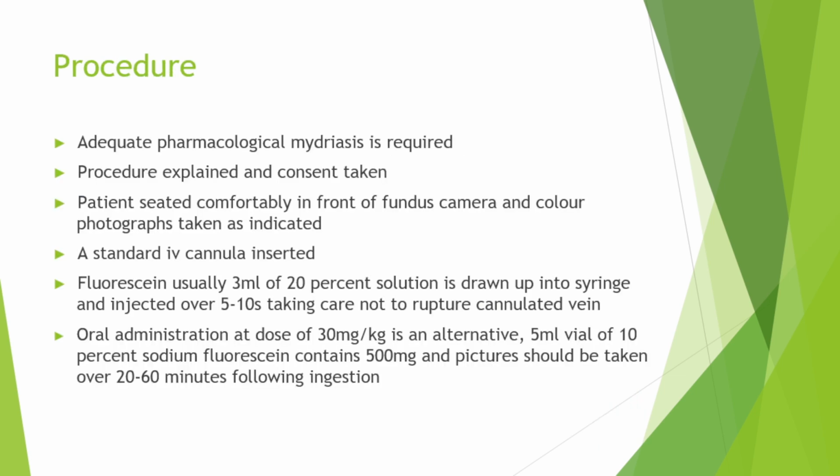Coming to the procedure, adequate pharmacological mydriasis is needed. The procedure should be explained and consent should be taken. The emergency resuscitation tray should be ready, and the patient should be seated comfortably in front of the fundus camera, and color photographs are taken.